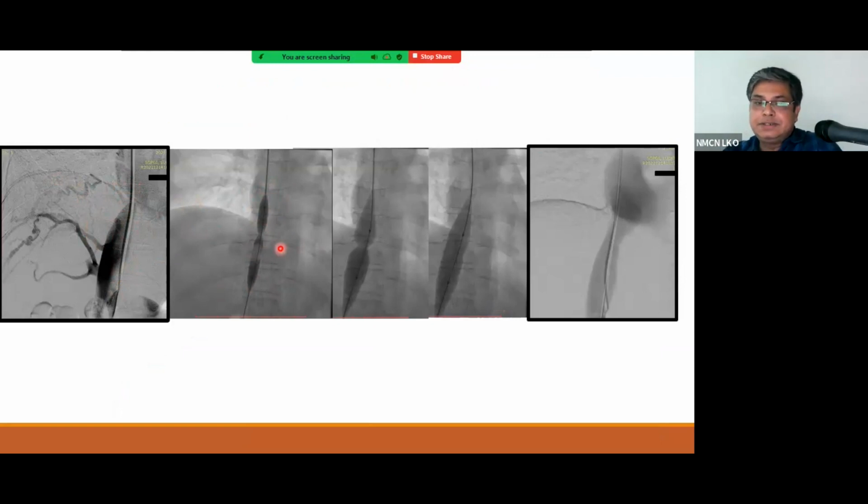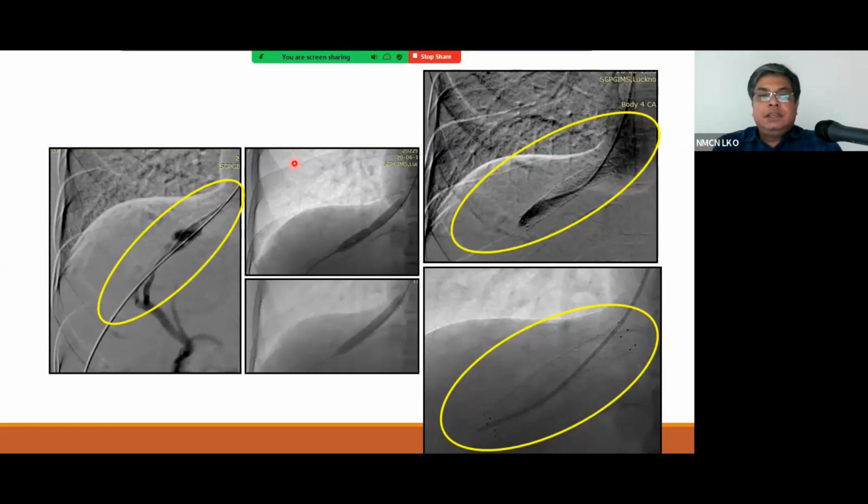Serial balloon dilatation is done with larger balloons. The balloon is fully deployed, and post angioplasty, we can see there is excellent restoration of antegrade flow from IVC to heart, just with angioplasty. This is another case where, by a transjugular approach, the RHV has been cannulated, and the venogram shows poor opacification of the right hepatic vein with drainage via collaterals.